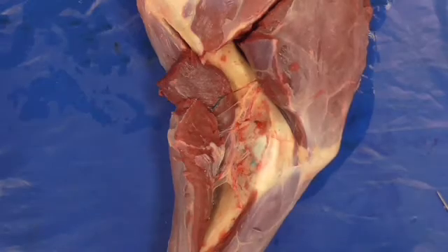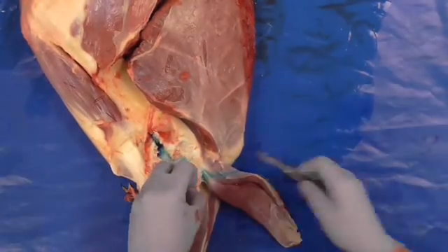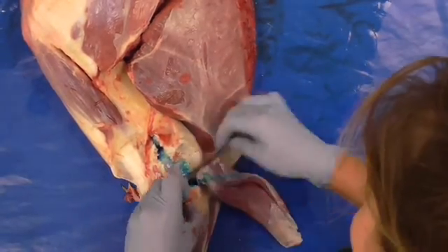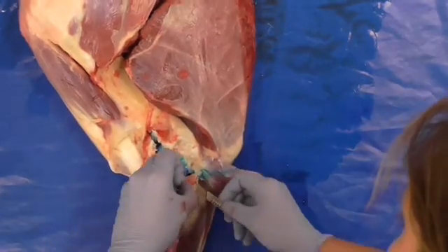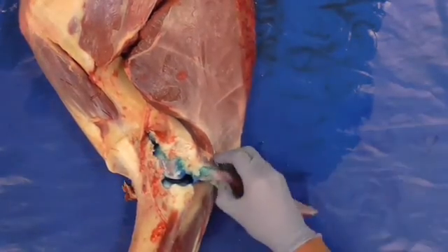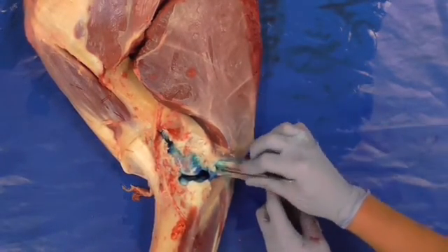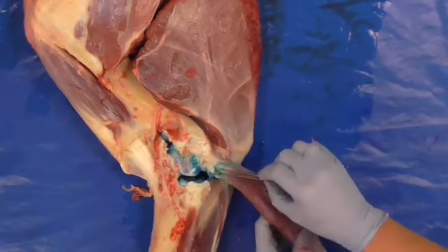No variation was found in the anatomical location of the nerve in the limbs dissected. The ulnaris lateralis bursa and the elbow joint were then opened to show blue staining, which was present in all 70 elbow joints and 40 bursas. In the limbs where communication was present, a window in the membrane between the two structures could be easily identified.